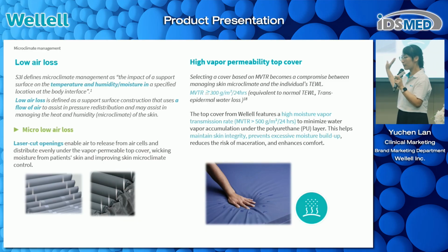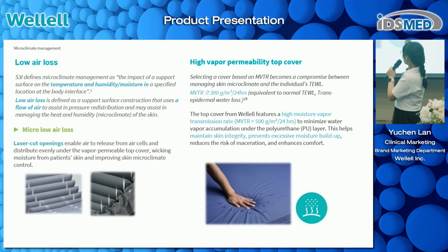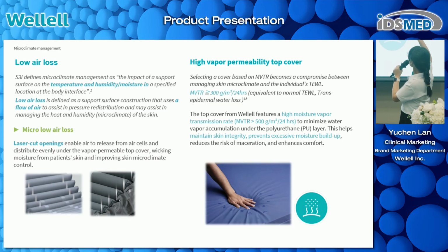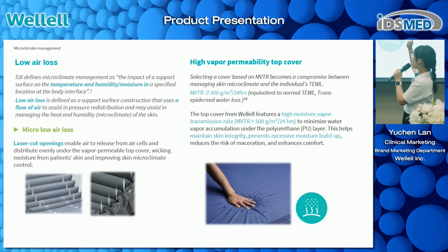Also, the top cover is crucial for our users. Based on the guideline, for the support surface top cover, the moisture vapor transmission rate, MVTR, the guideline recommends that the value shall be more than 300 grams per square meter per day.